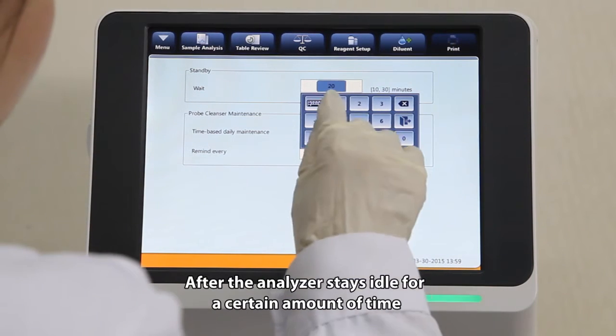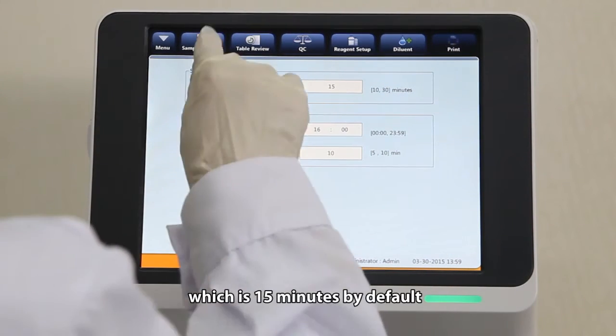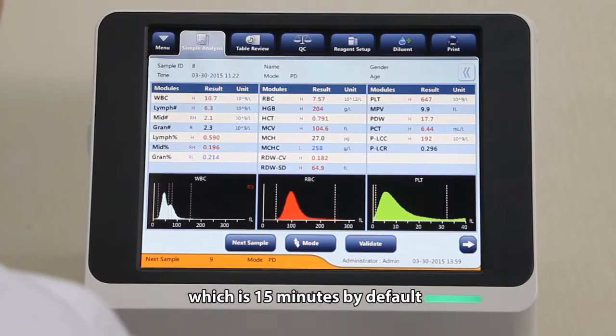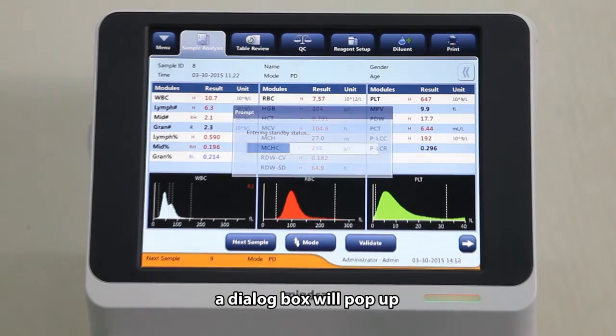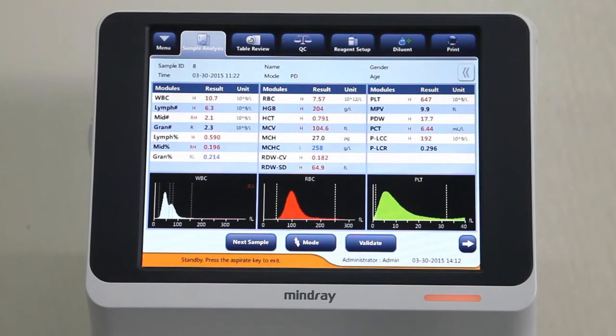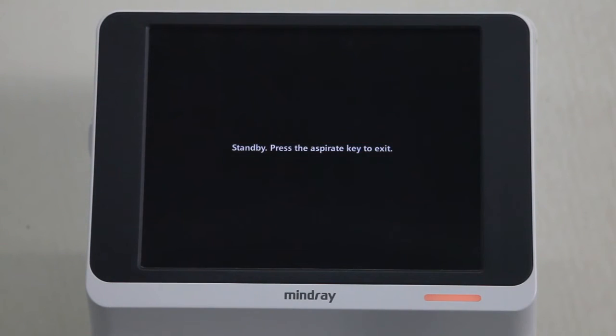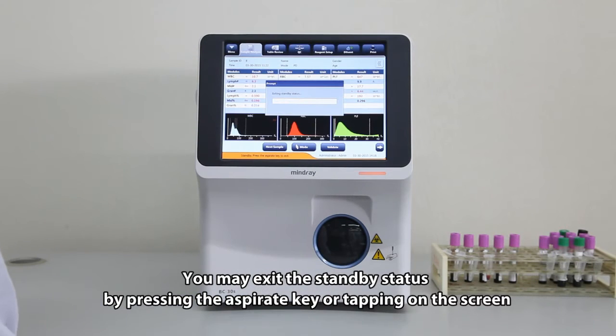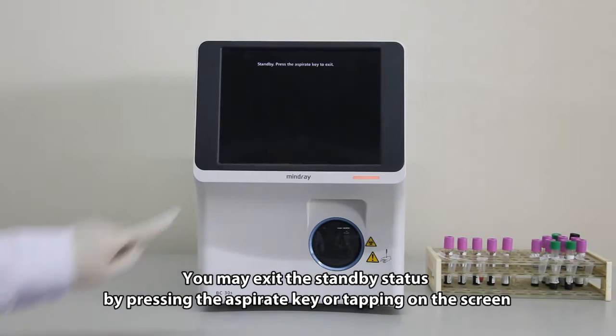After the analyzer stays idle for a certain amount of time, which is 15 minutes by default, a dialog box will pop up prompting entering standby status. You may exit the standby status by pressing the aspirate key or tapping on the screen.